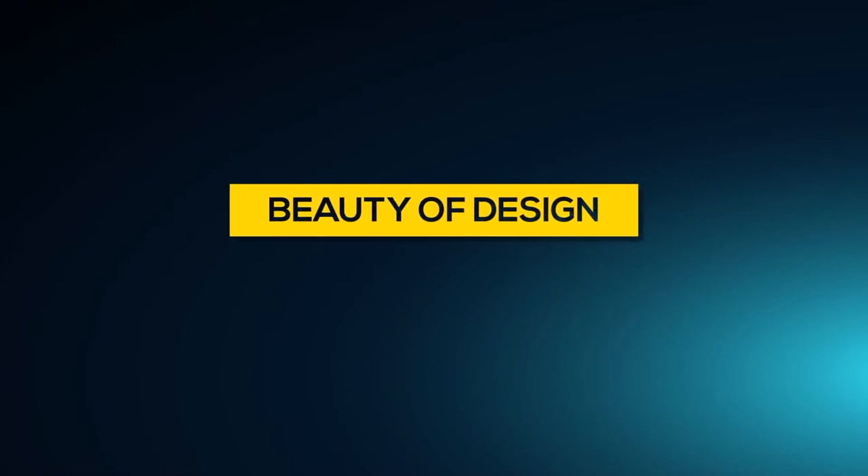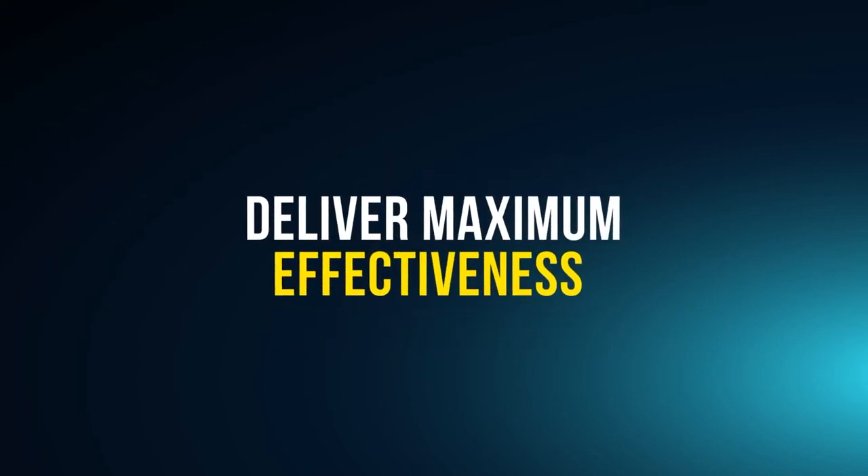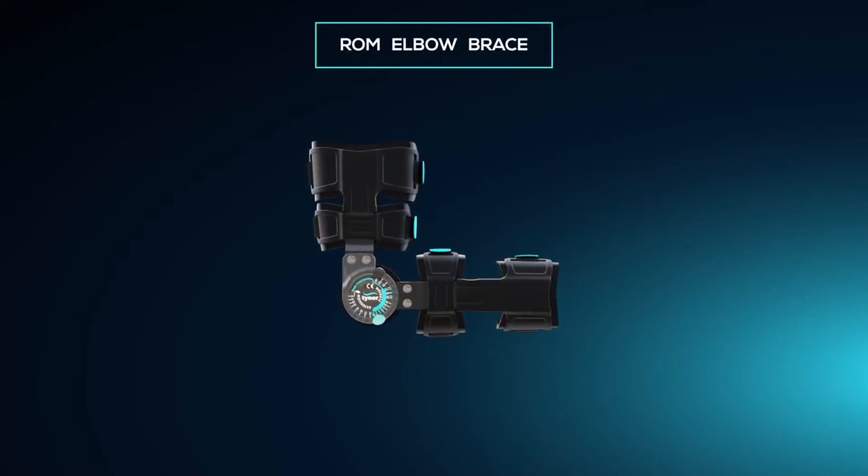The beauty of design is when a product is simple to operate, appealing in looks, and delivers maximum effectiveness. Tynooil brings you this beauty in the new range of Motion Elbow Brace.